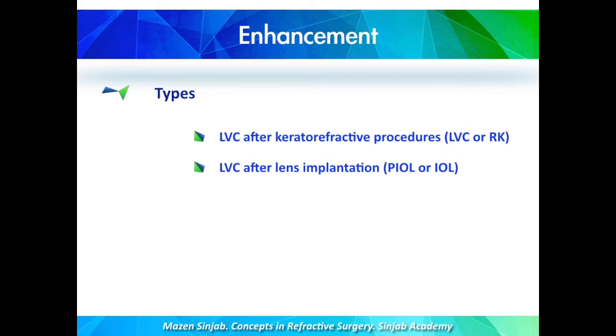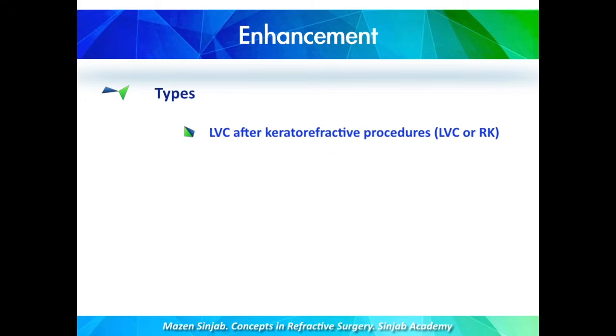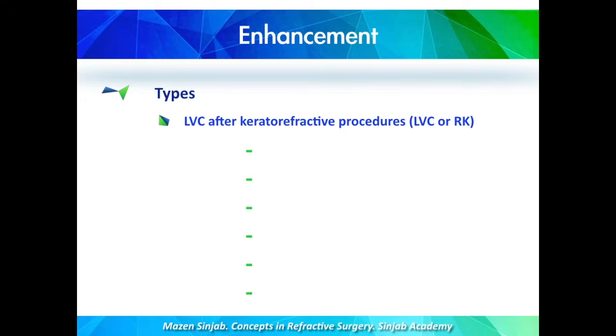Coming to the other two types, according to what we are going to do. Are we going to do laser vision correction after previous keratorefractive procedures, or we are going to correct any residual refractive error or induced refractive error after lens implantation? Starting with the first one. There are several types of this type, or let us say there are several subtypes of this type.